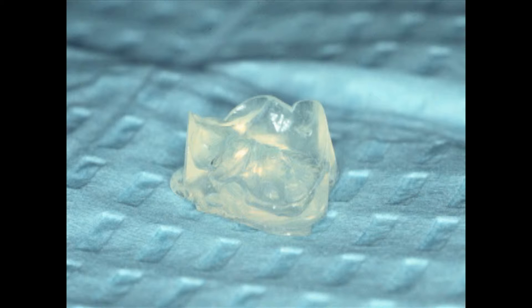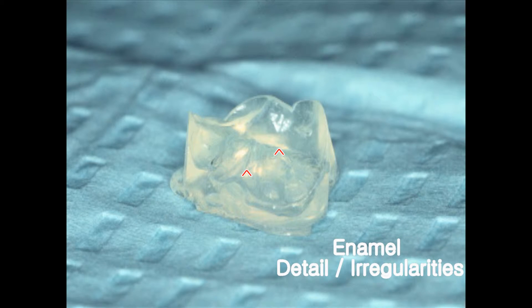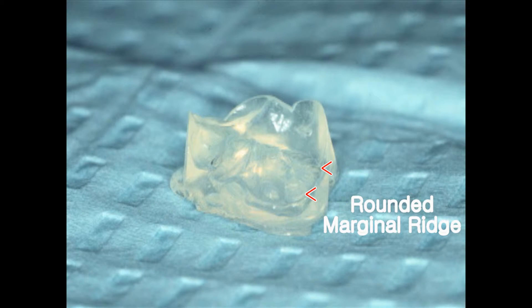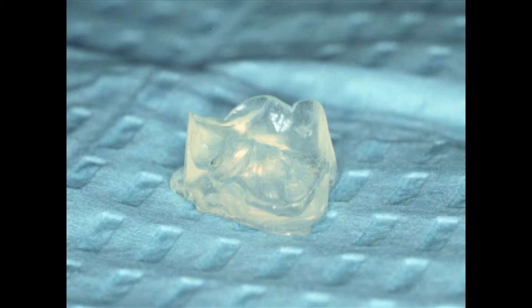This is the custom matrix after it's set — it takes about a minute to a minute and a half to set up. Take a look: it's not easy to see, but notice the subtle enamel irregularities in the surface and the rounded marginal ridge. When was the last time you did a posterior composite and had a nicely rounded marginal ridge? This small matrix looks like a button made inside your matrix band.